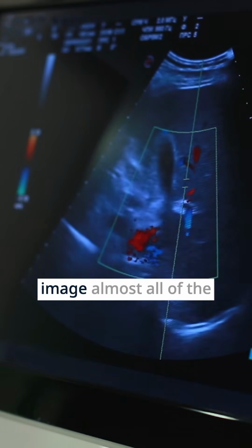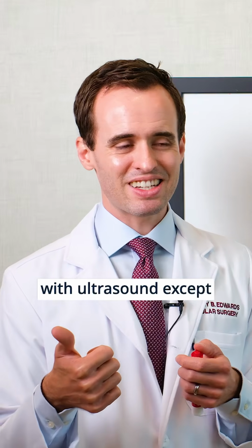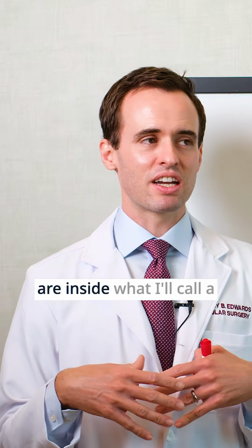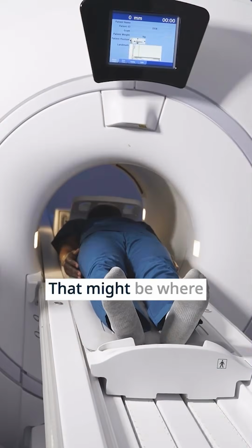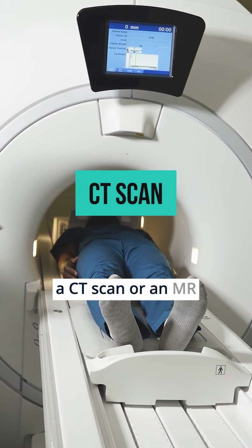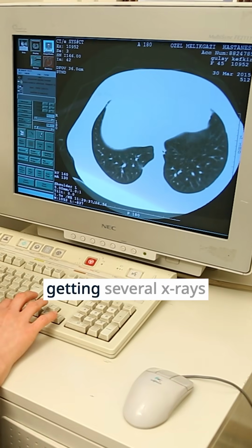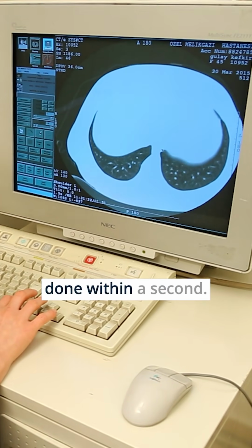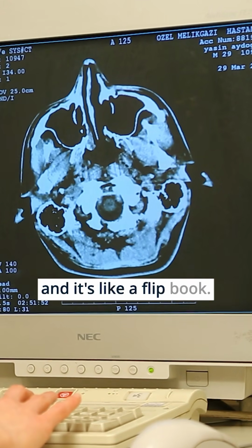We can image almost all of the blood vessels in the body with ultrasound, except the blood vessels that are inside what I'll call a bony space. So like the blood vessels in the brain, that might be where a CT scan or an MR scan comes into play. What you can think about here is it's like getting several x-rays done within a second, and then we stack all those x-rays together, and it's like a flip book.